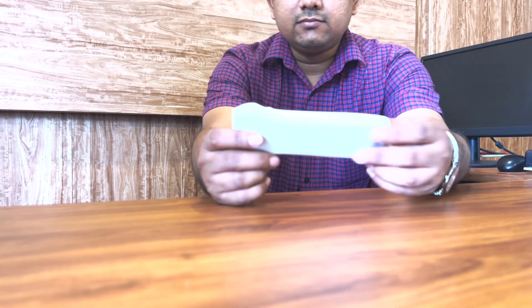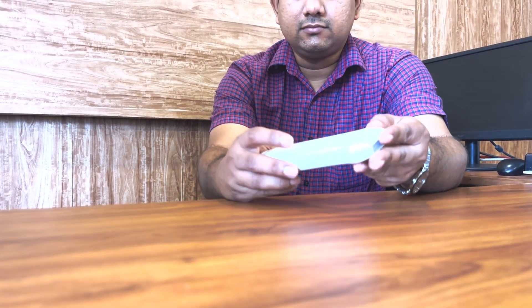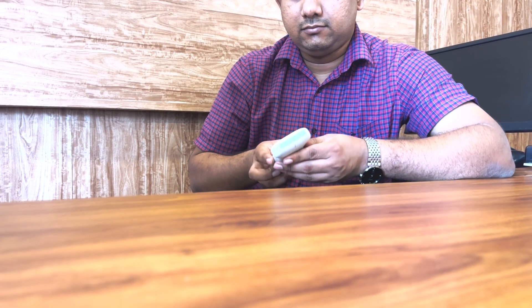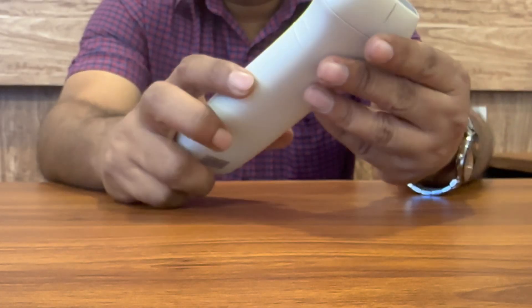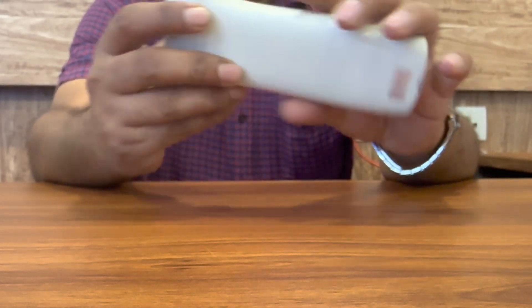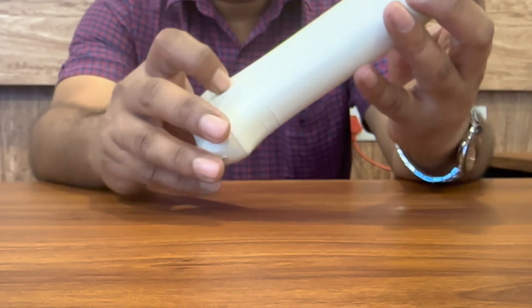Hi, today I am here to demonstrate a very useful product in our daily practice as a doctor. That's a wireless portable ultrasound device. This is a full linear ultrasound system. Today I will demonstrate how to do an ultrasound study with this probe and the basic features of the app.